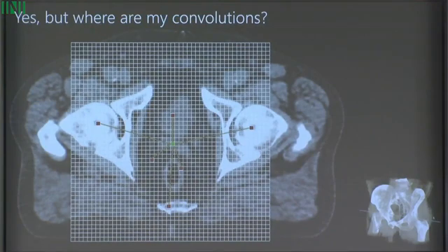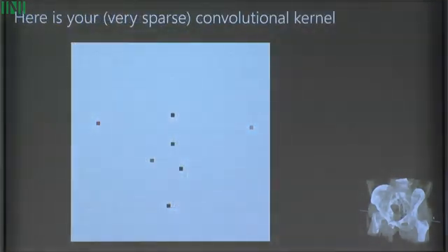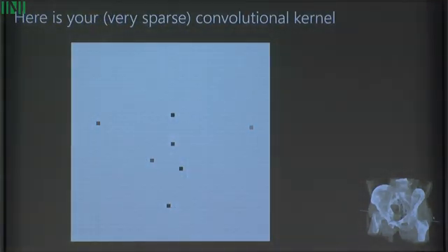And this is key, because what we managed to do is come up with a learning scheme where the number of parameters is hundreds of thousands as opposed to millions or perhaps even billions, which allows us to learn from a small number of images, and also from a small number of examples, thereby avoiding the usual overfitting issues that one finds when there's not enough data. Yeah, so this is our way of thinking about what these convolutions look like.